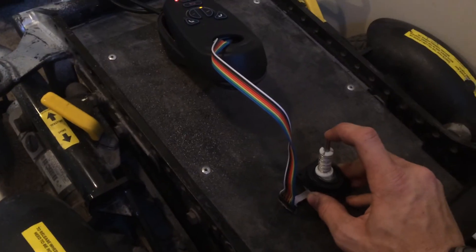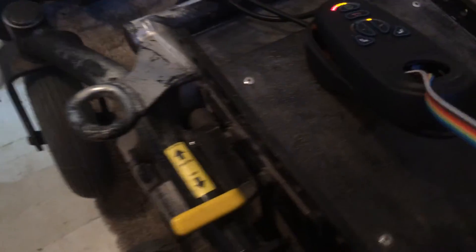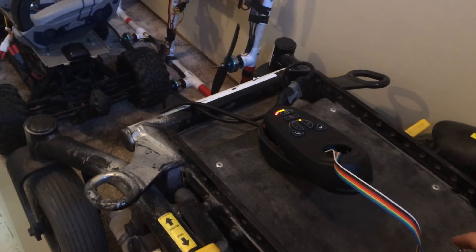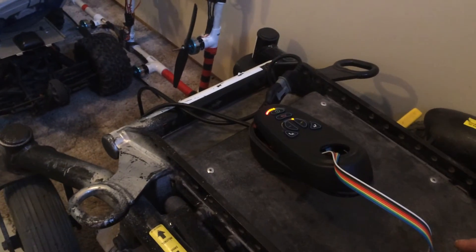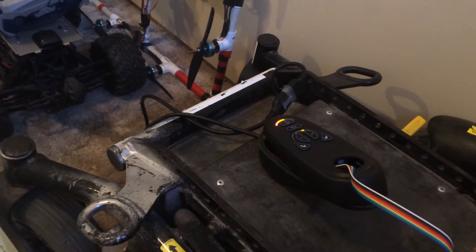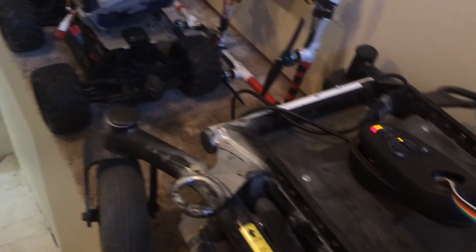Go forward. You can see all those clutches — you can see it just real quick. Try and go forward a little bit. Back a little bit. Turn to the left. Turn to the right. And so she works.